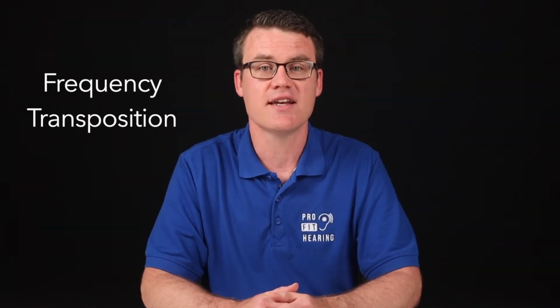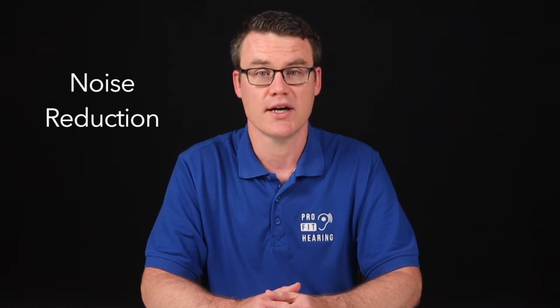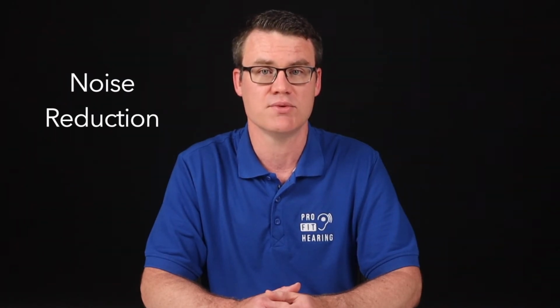Disable frequency transposition or frequency shifting. This setting is often used to optimize speech understanding for people with high frequency hearing loss. It works by moving the high frequency sounds into a lower frequency range so that it's easier for a hearing impaired person to understand speech. However, this setting will distort music sound quality. You can also disable noise reduction. Noise reduction can impact the low frequencies or the bass response in music.